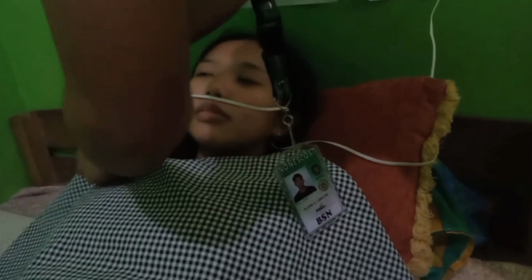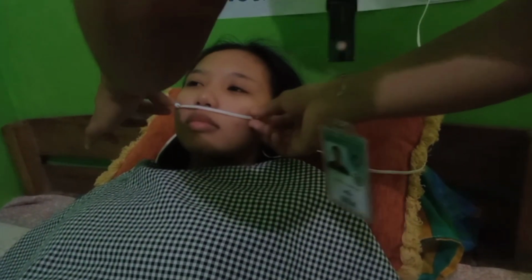Assess for proper functioning of equipment and observe client's initial response to therapy. Assessment of vital signs, oxygen saturation, color, breathing pattern, and orientation helps the nurse evaluate effectiveness of therapy and detect clinical evidence of hypoxia.